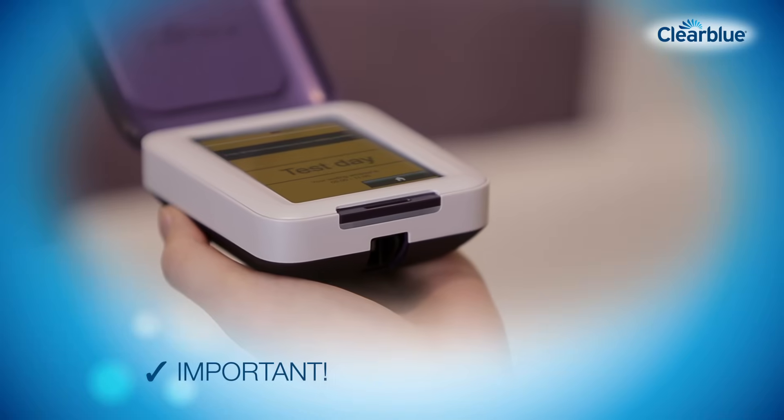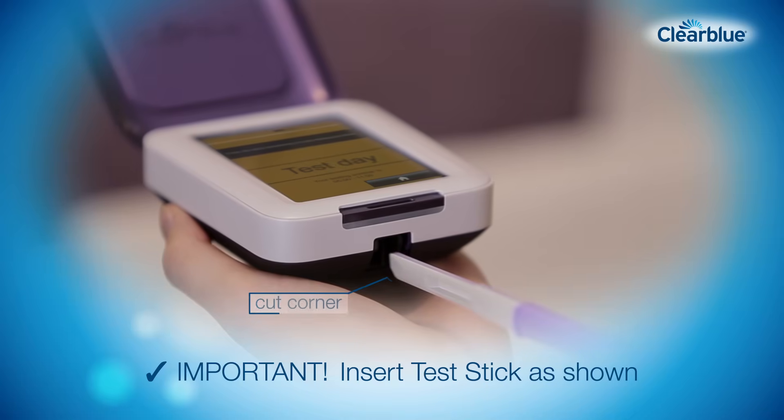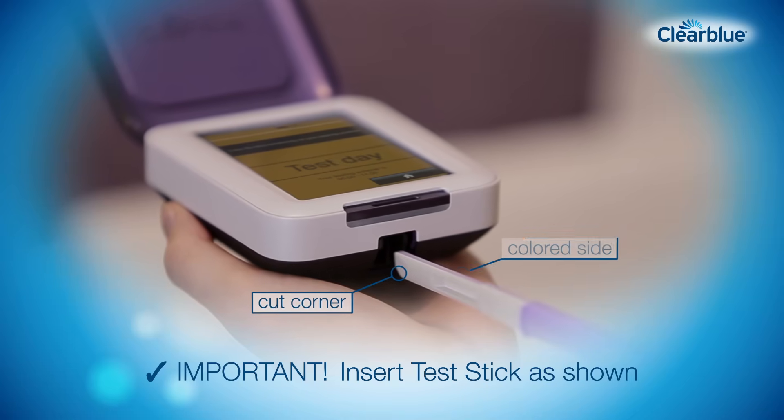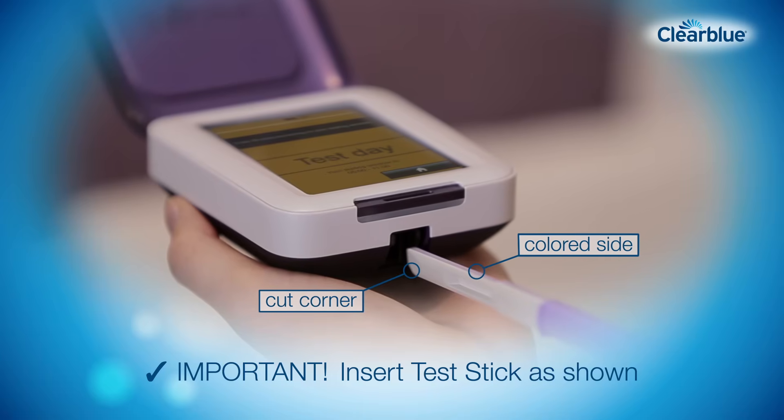Then insert the test stick into the monitor immediately. It's important that you do this as shown. Hold the test stick by the cap, with the cut corner facing down and the colored side of the test stick on the right. Insert it into the test stick slot until you hear it click.